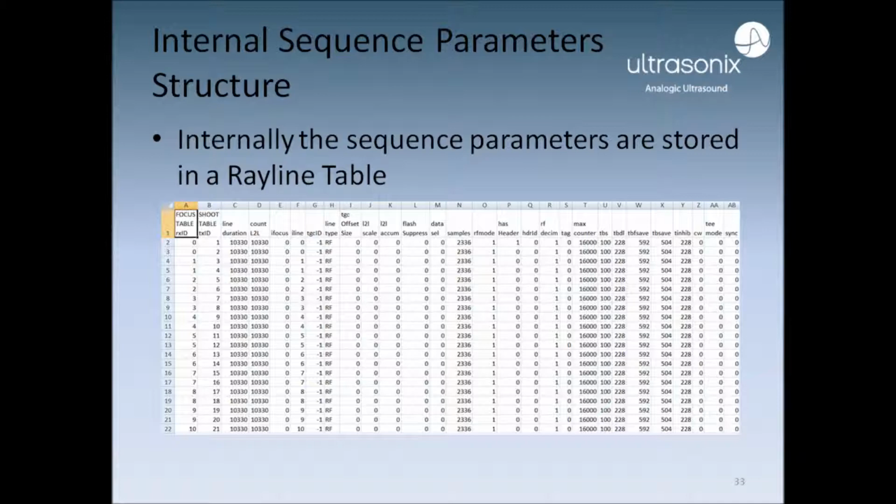It is important to emphasize that our sequencer always performs a single transmit and a single receive. It is not possible, for instance, to do multiple transmits and then do a receive. Although it is possible to associate dummy receives to some transmits, the receives should be there even if they are of zero duration.